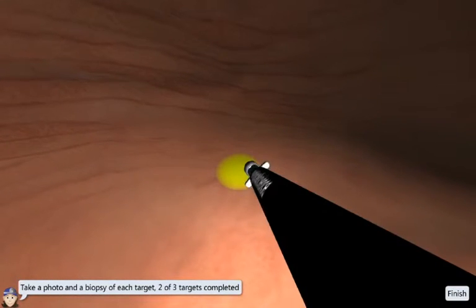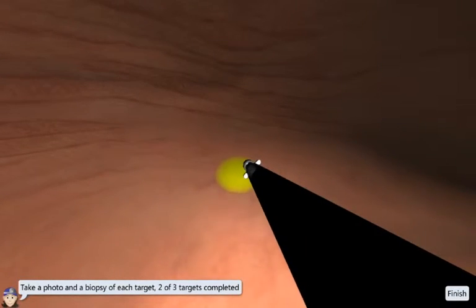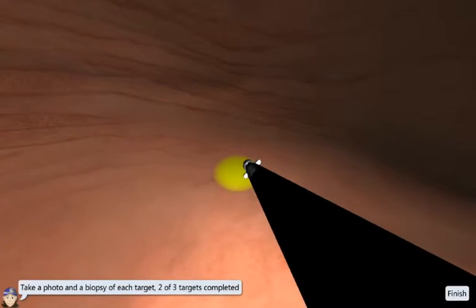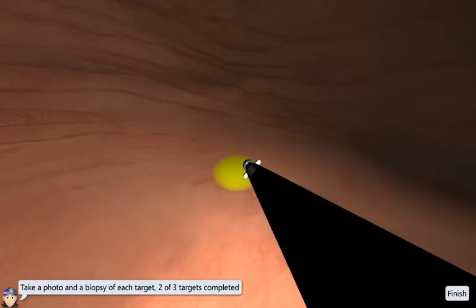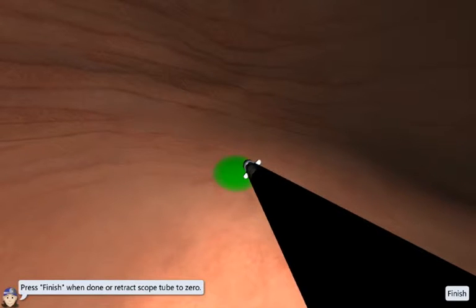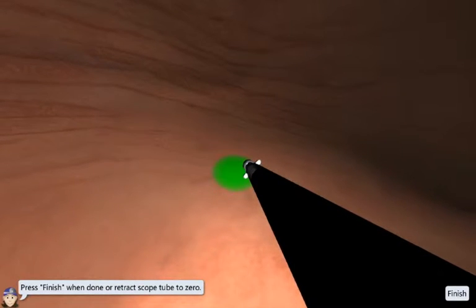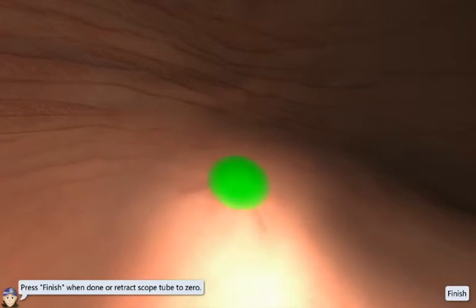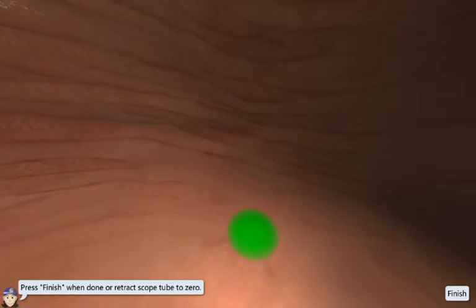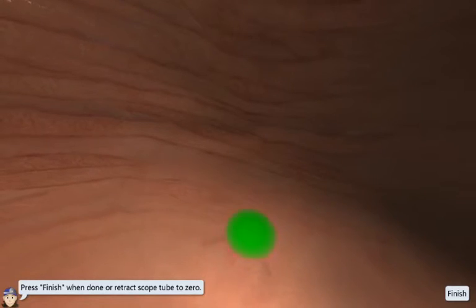The target becomes green if a correctly performed photo and a biopsy sample have been taken of the target. Make sure to examine as much as possible of the mucosal wall of the stomach and the duodenum.